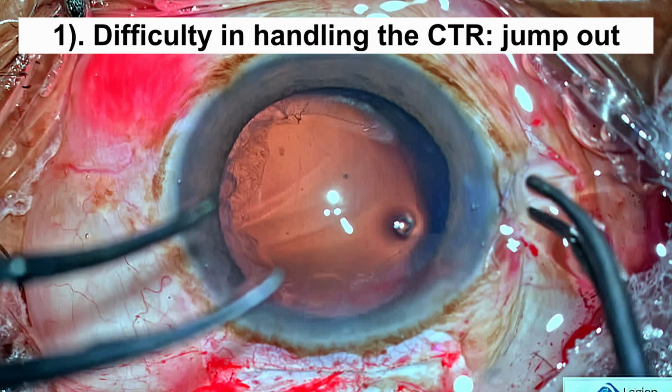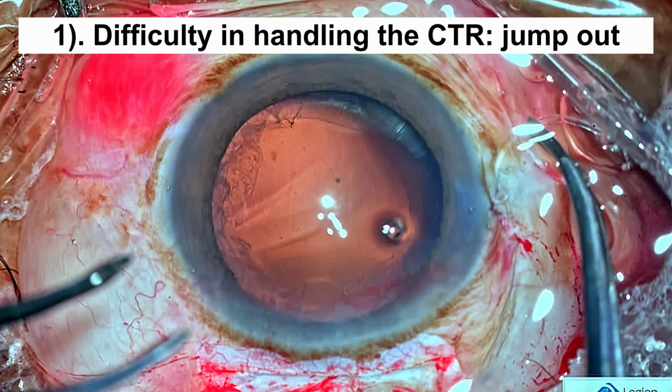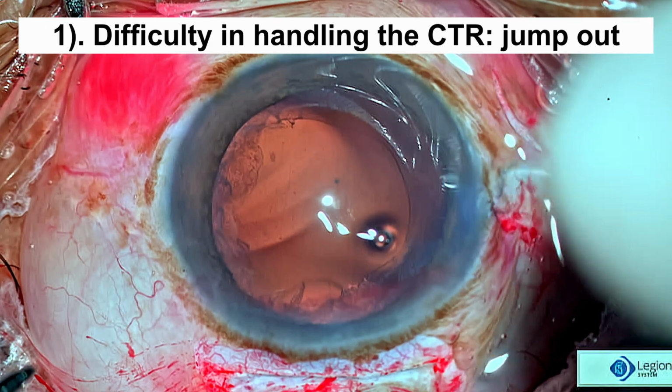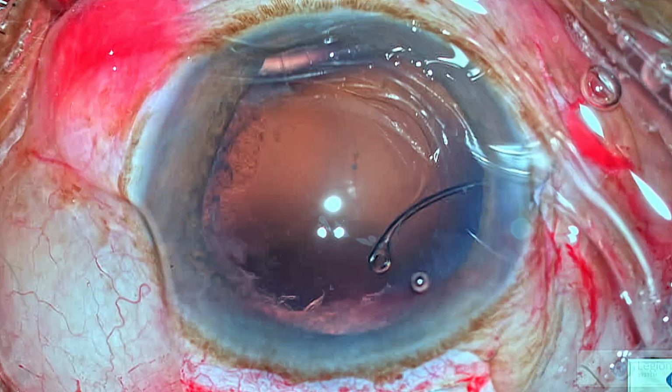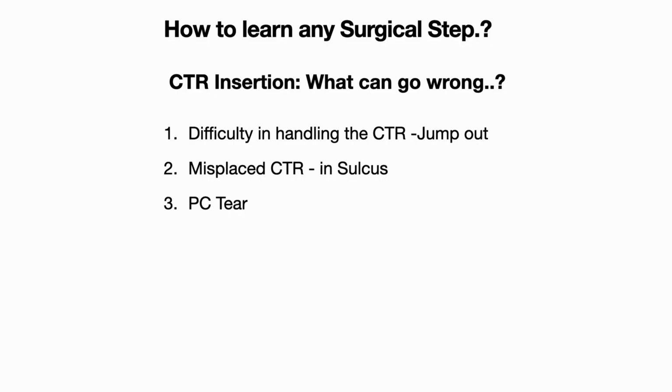The first time you're going to handle the CTR, it's going to be very flimsy, you're not sure about its consistency, and more often than not, it's going to jump out and fall. When you're introducing the CTR, you can just misplace it, put it in the sulcus itself. We can induce a posterior capsular tear while trying to ferociously negotiate a CTR into a capsular bag.